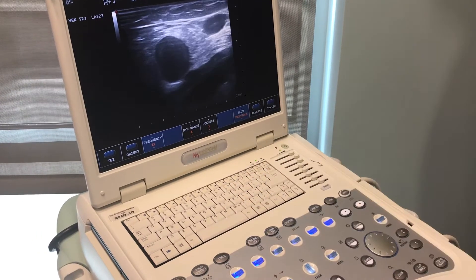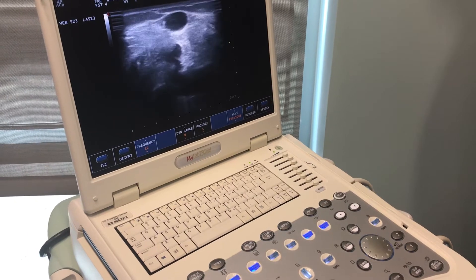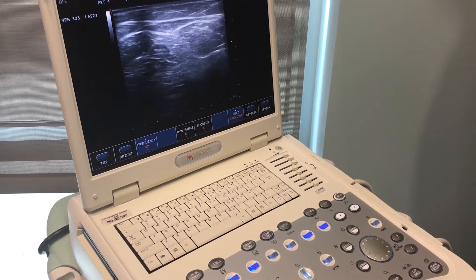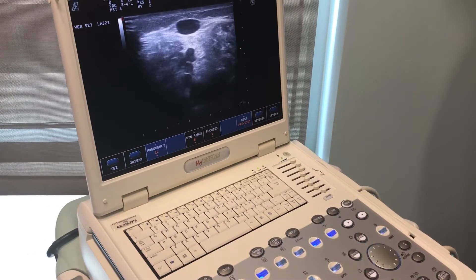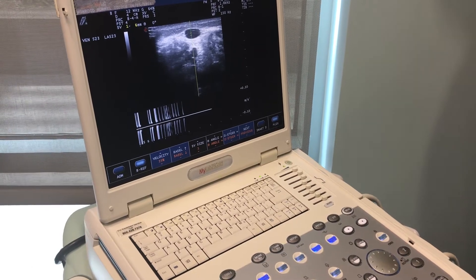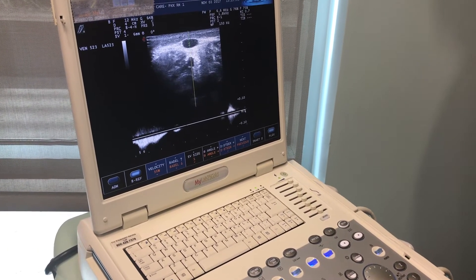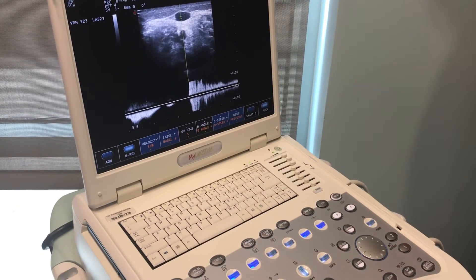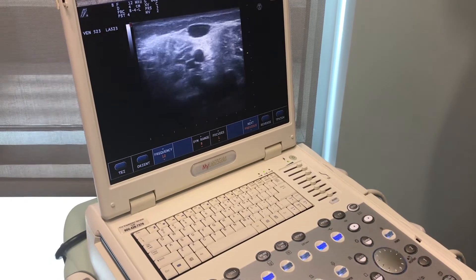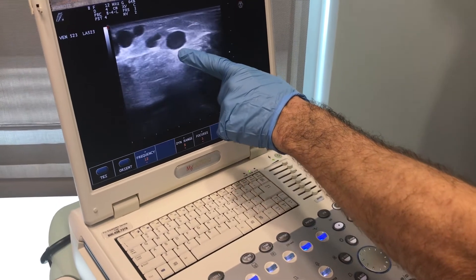He's got a large, almost dilated vein segment there. This is the vein where the blood is actually supposed to be going up and going into the deep system, but it's coming backwards. When we look at a patient like this, we can listen to the blood flow. I'm going to push a little bit of blood up that vein then let go. This is all the blood flow coming back — you can actually hear the valves. We're going to go down to the skin and see where these branches are coming from.